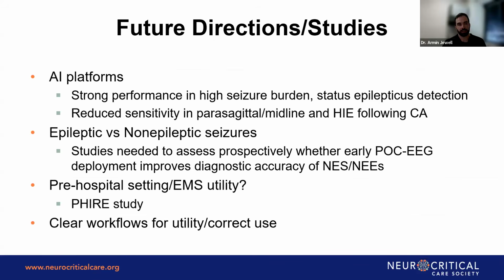So lastly, future directions. There are multiple different areas that point of care technology is going. Part of it is with the AI platforms and how to accurately detect status and seizure burden early. That's ongoing through both Zeto as well as others that are trying to develop a way to accurately link the AI technology with a quick clinical interpretation, to get an accurate diagnosis quickly to the treating clinicians.